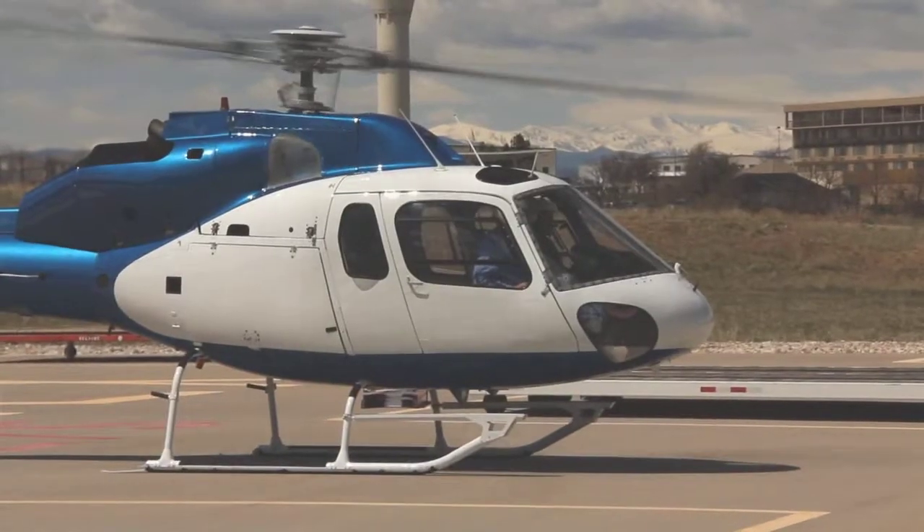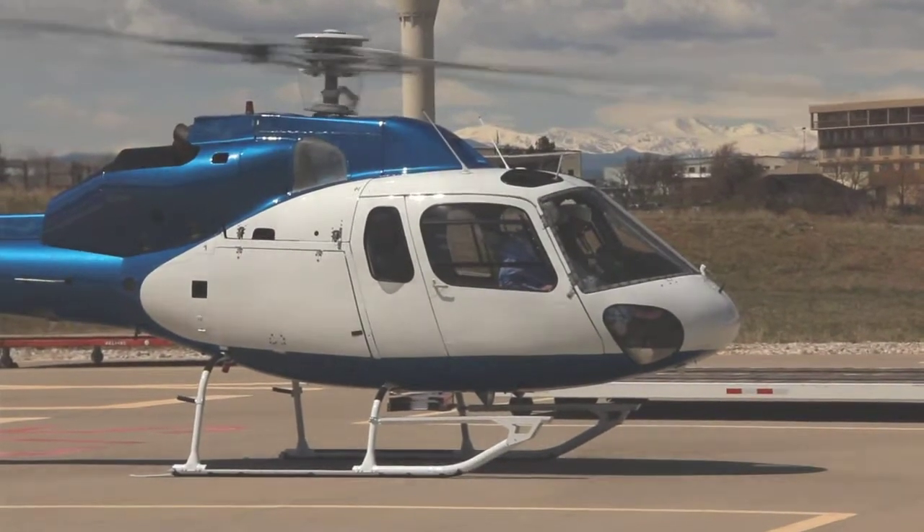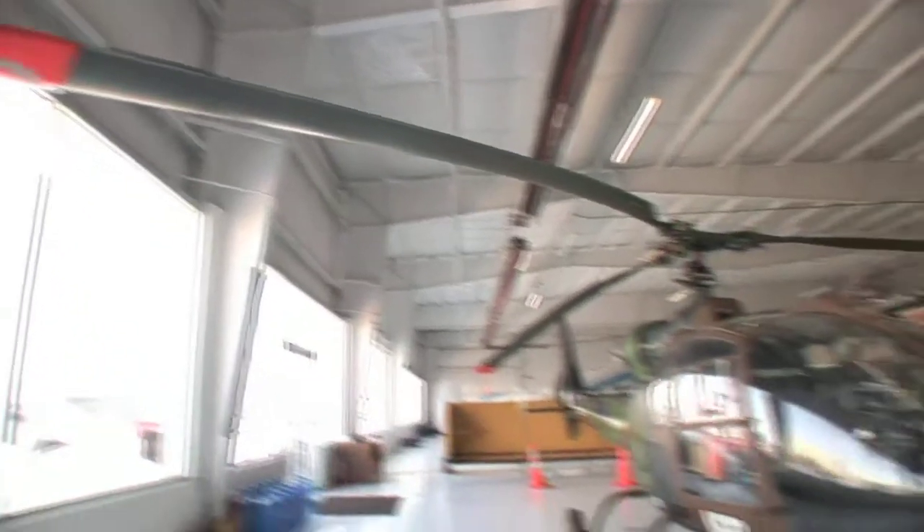Later on I was approached after a spinal cord injury to devise a system that would allow paraplegics to fly anything from gliders, fixed wing, and ultimately helicopters. Helicopters was by far the hardest challenge. Not only do we have to work with our hands but we also have to use our feet, and in essence we have five controls.